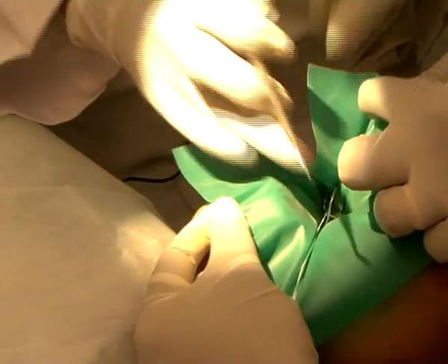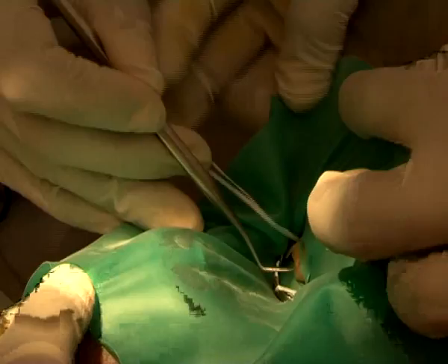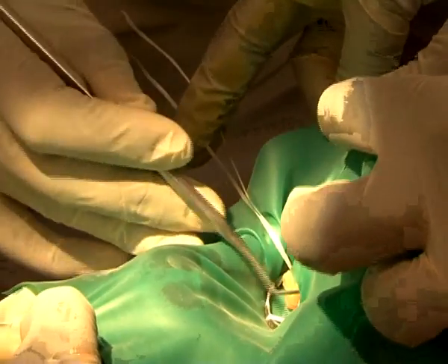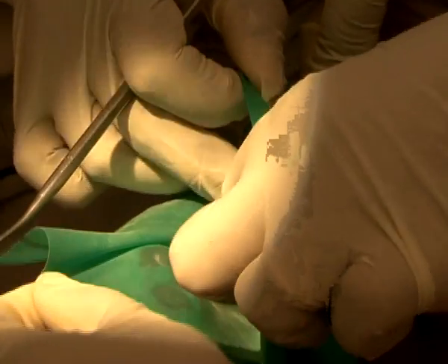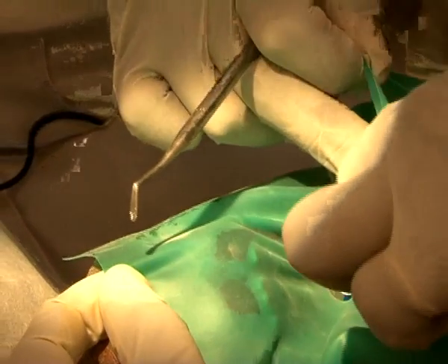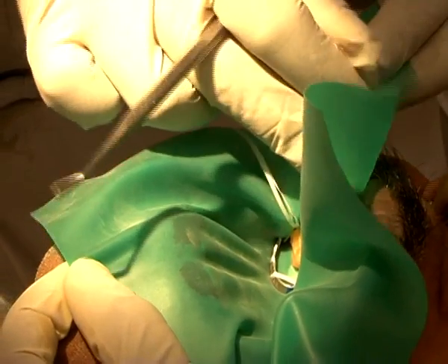You will have a small bit of discomfort and that's it. We are going to place the rubber dam over the clamp and slide it over. Now you can see he has a very tight contact here — we are going to worry about this a little while later. I am going to secure the anterior tooth, place it on the right side, and get the frame organized.